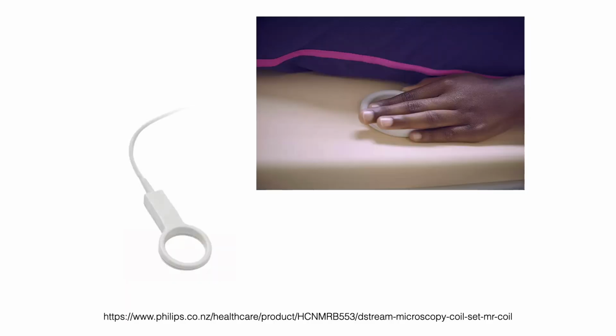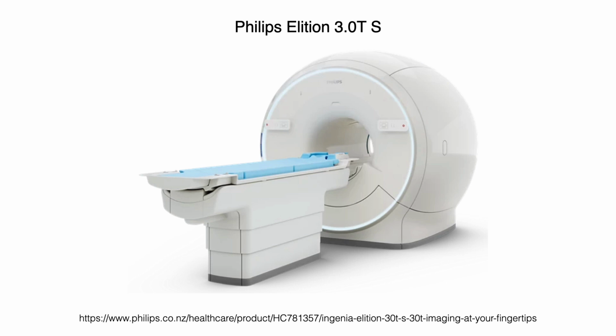This is one sold by Philips. This is a rather small one, and it's used to see things close to the surface that are very small. Here's an MRI machine, and underneath the plastic sheathing of this MRI machine, there's a coil to sense larger parts of the body. It's called the body coil.